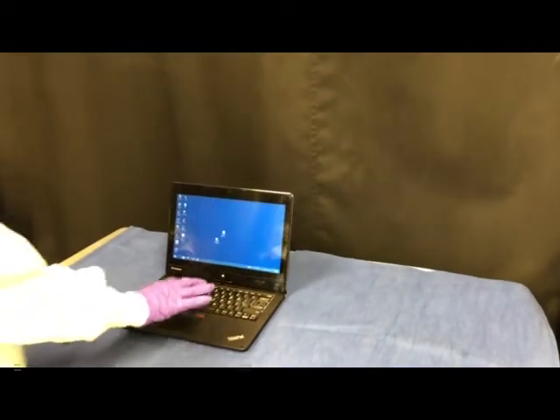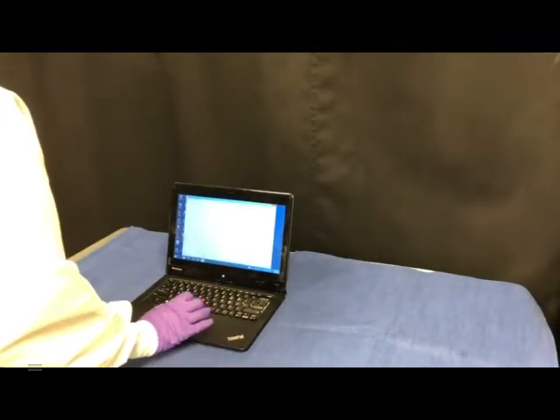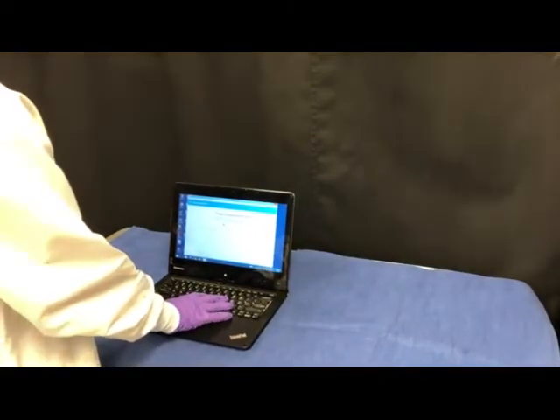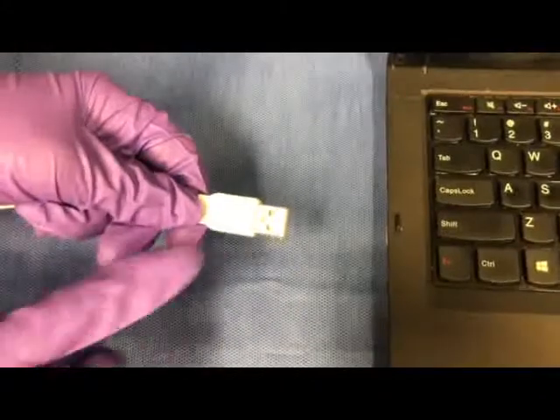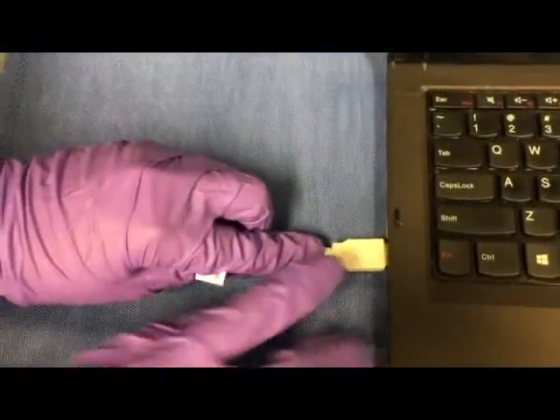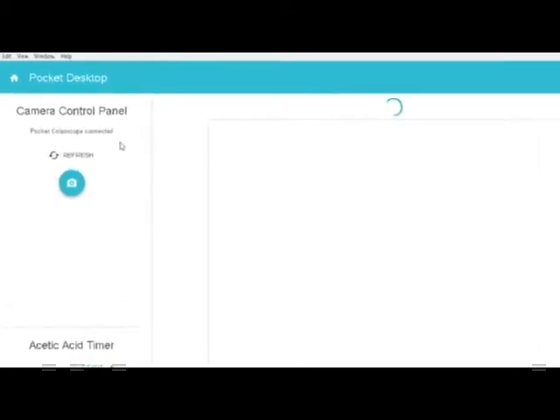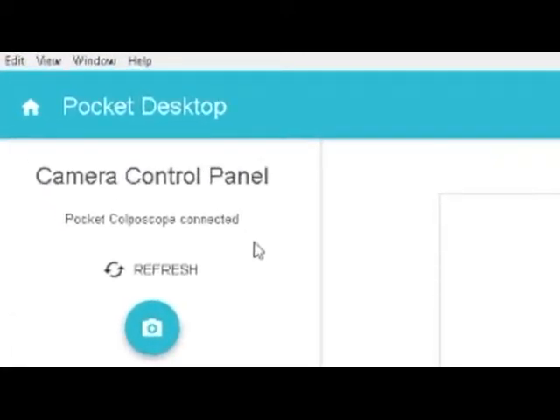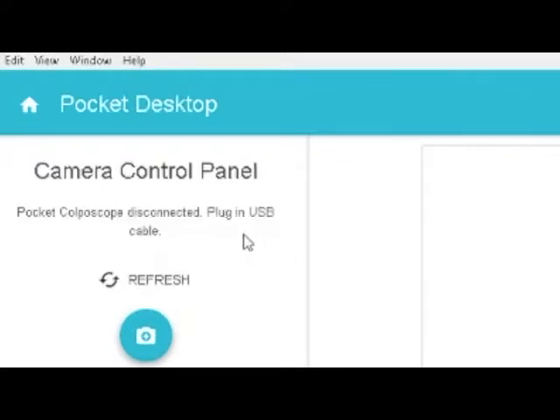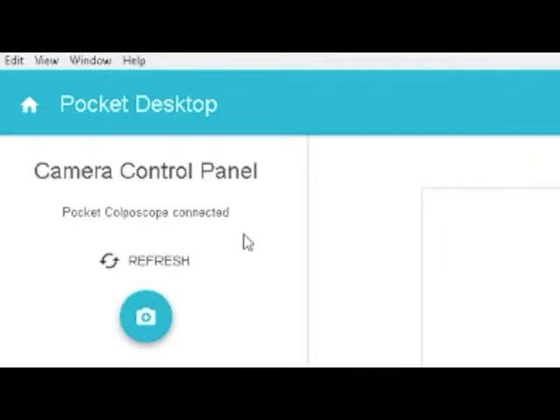Before using the device, your computer or tablet must have the pocket colposcope software installed. After installing the software, navigate to the program on the computer and double-click to launch. Plug the pocket colposcope USB connector into the USB port or adapter and ensure the device is fully plugged in. Click Start Exam on your computer. A connection confirmation message in the camera control panel should appear. If the message says pocket colposcope disconnected, plug in USB cable, plug the USB back in and then click the refresh button. You are now ready to begin a clinical exam with the pocket colposcope.